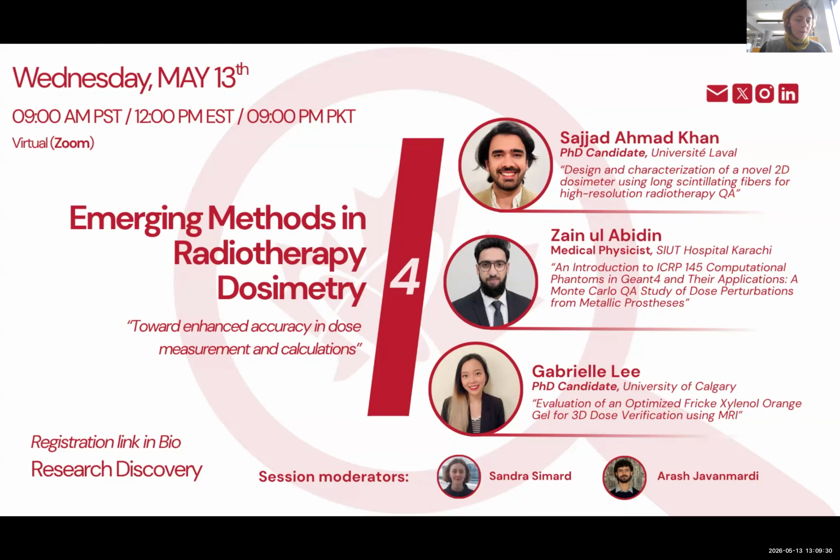Yes, we have a question from Finn. Yeah, sorry. If no one else has a question, I maybe would have a follow-up to my question for Sajad. It was a very interesting talk, thank you. But I was just wondering, if you are increasing the pitch physically within the layers, the stacks, then does that not restrict you to being specific to the beam that you're measuring? Because the widening of your beam would be specific to the 6MV with a certain SAD and your setup.